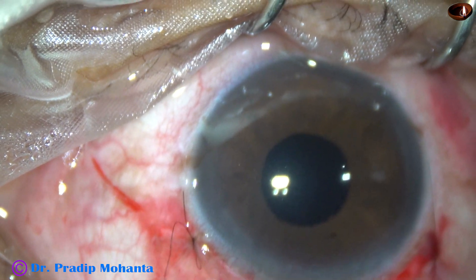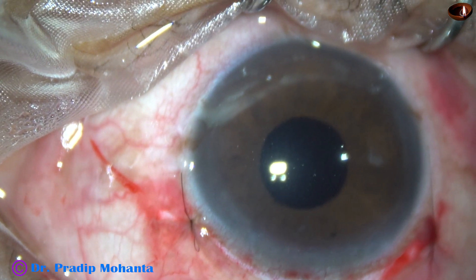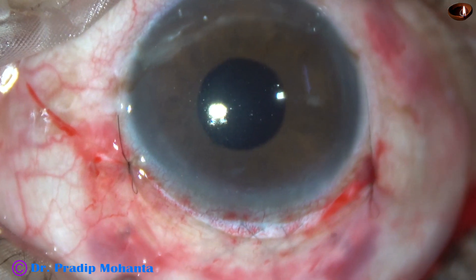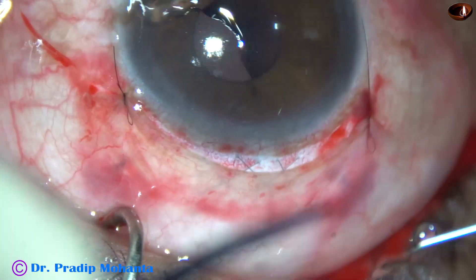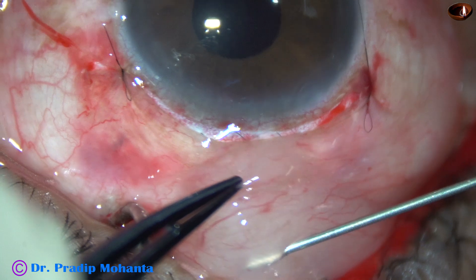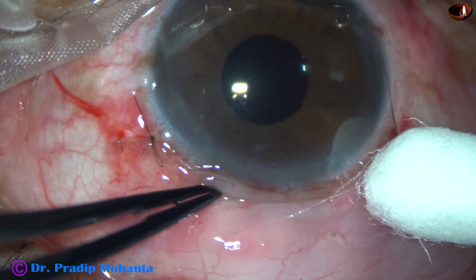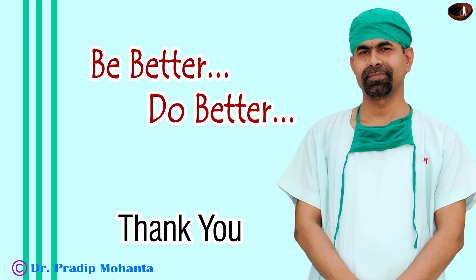Now two anchoring sutures on either side of the peritomy — these are releasable sutures. You can see that the pupil is round and there is no vitreous in the anterior chamber. Now a subconjunctival injection of gentamicin and dexamethasone, so that the conjunctiva gets apposed to the limbus. Hold it here for a few seconds, and we conclude this surgery.